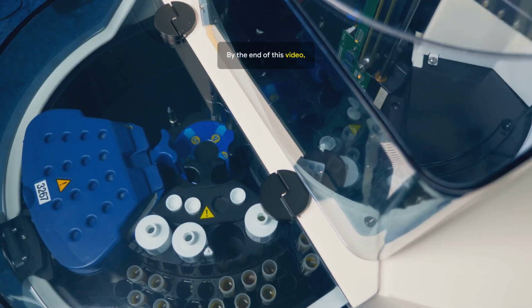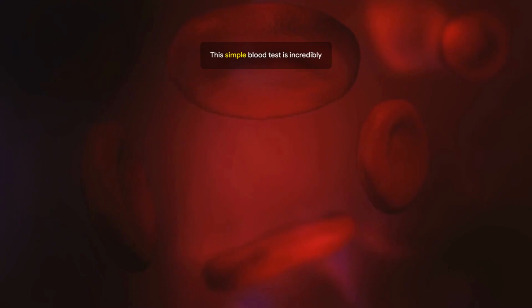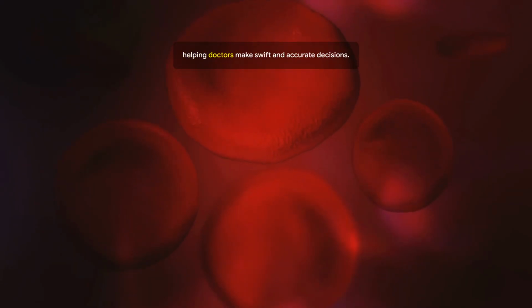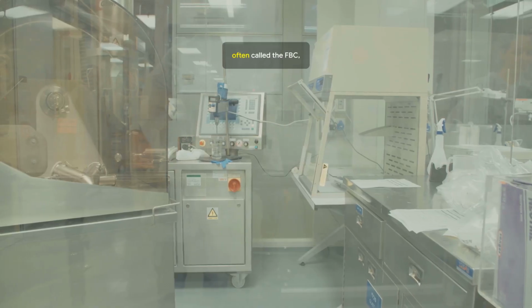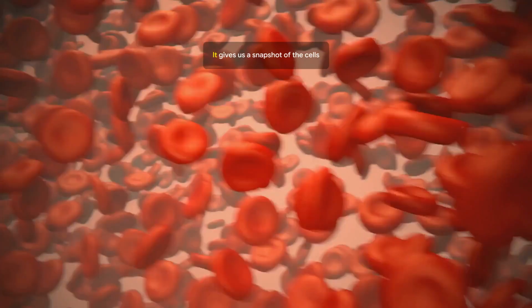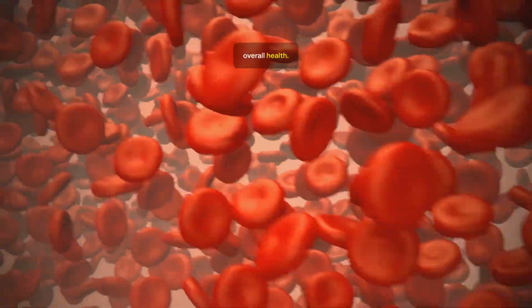By the end of this video, you will be able to interpret a full blood count result and spot common abnormalities. This simple blood test is incredibly powerful. Understanding it is a fundamental clinical skill, helping doctors make swift and accurate decisions. The full blood count, often called the FBC, is one of the most frequently requested blood tests within the NHS. It gives us a snapshot of the cells circulating in your blood, providing essential clues about your overall health.